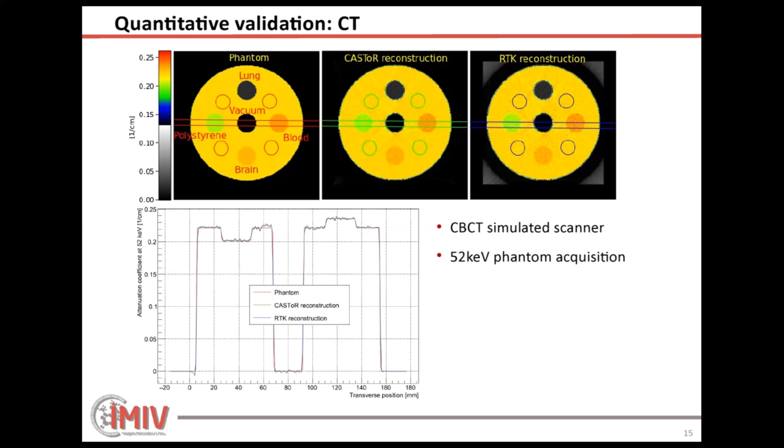Why is it that you're 10 times slower than Biograph? I have no idea how fast Biograph is, really. Yeah, it is quite fast because it uses SIMD vectorial computation, and it's also certainly optimized with respect to the geometry. I remember the reconstruction for the Biograph is always with a voxel size matching the sinogram size. It's an implementation from, I don't remember the name of the guy. Inki Hong? Yeah, exactly. So there is a matching between the sinogram view radial spacing and the voxel spacing, and the image is shifted with respect to the view of the sinogram.